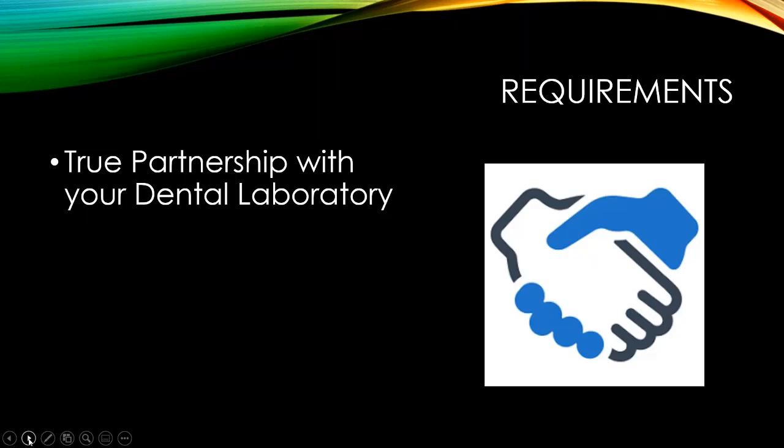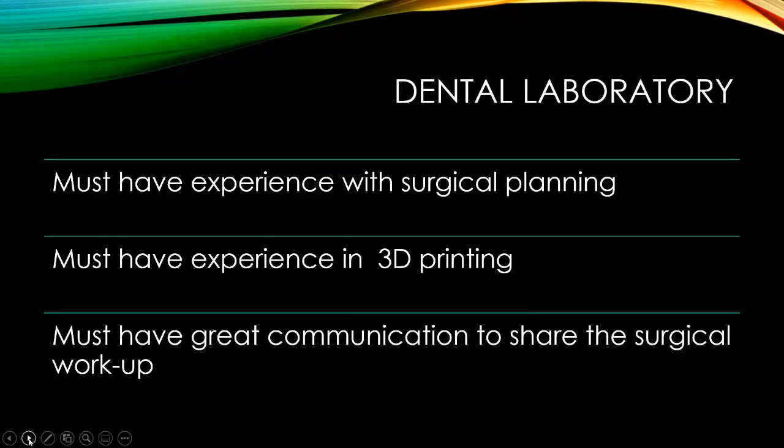So there's definitely some requirements in doing a precision guide. You have to have certain things, and the most important thing is a true partnership relationship with your dental laboratory. Coming from a lab background, I can't stress that enough, how important it is to have a good relationship with your laboratory. But in this instance, it's even more important because of the level of expertise that's needed here. So a lab that you work with must have experience with surgical planning. They must have experience in 3D printing, and they must have great communication.